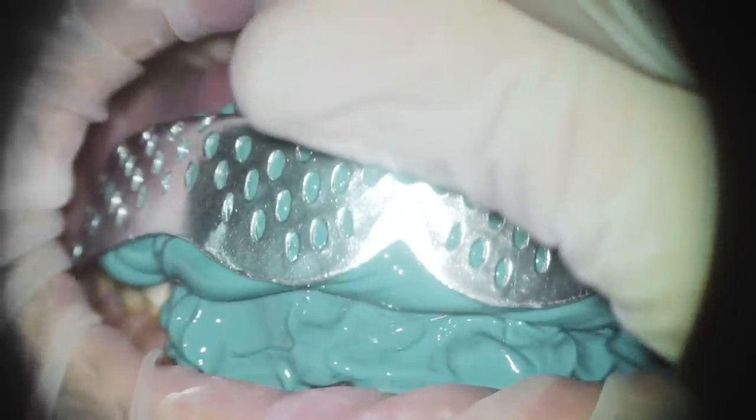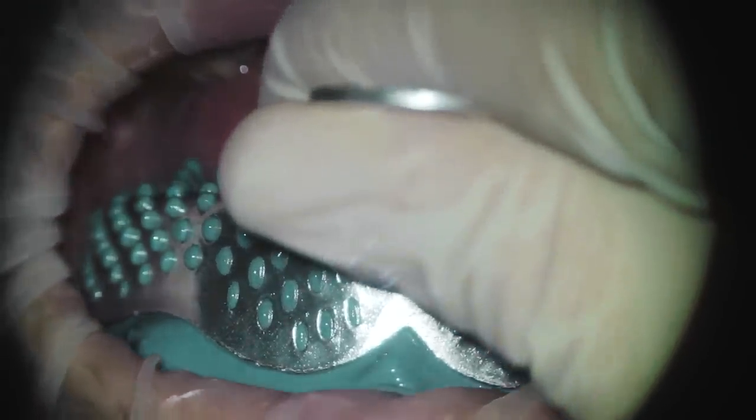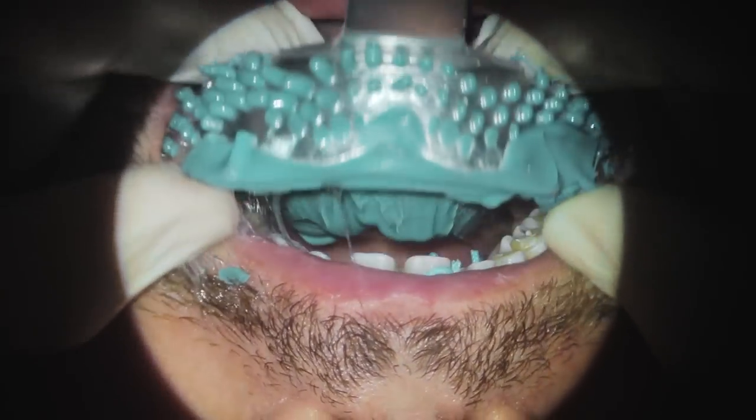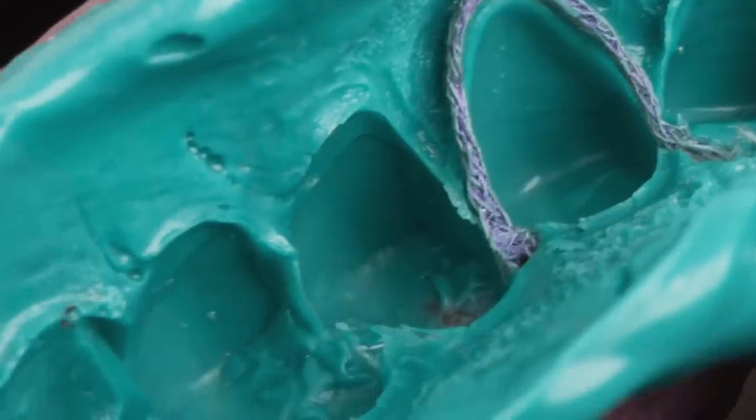I like to use a rigid impression tray because when I put the impression material in the mouth, I always do it in a vertical motion — and you should too. I don't use the rocking motion we were all used to, because it can deform the impression. I like to take it out in the same vertical motion as I placed it. If you don't have a rigid tray, you will deform the tray and with it the impression.